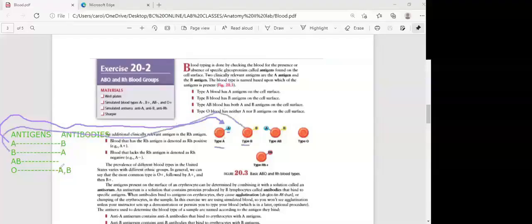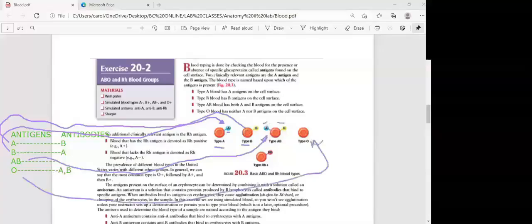Blood type B. If you have antigens AB, they're being displayed in your red blood cell, therefore they're going to be called A and B. And again, if you have O, then obviously you have nothing, right? As you can see, there is O because you have no antigens. This is one way we're going to group the red blood cells. So right here it says blood groups.